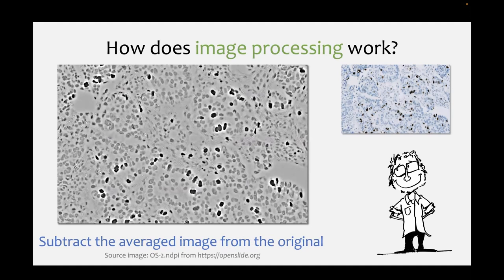We subtract the values after averaging from the ones before averaging, and this is what we get. That already starts to look like it could be useful, because it helps the nuclei kind of pop out a little bit from the background. This image also has some nice properties in that the overall average is zero - it doesn't really matter what you started with, the overall mean of this is zero, which is probably not the case with any arbitrary image. You can start to get some nice properties whenever you do these processing operations.